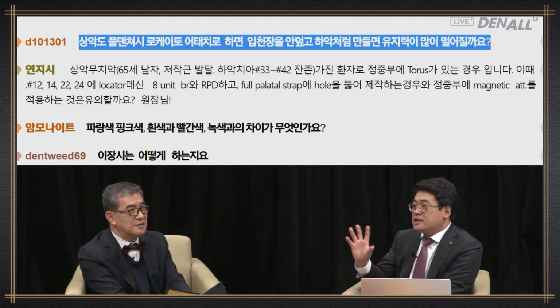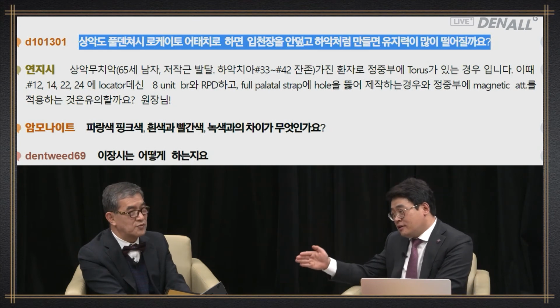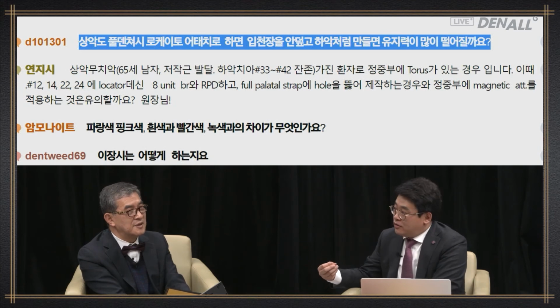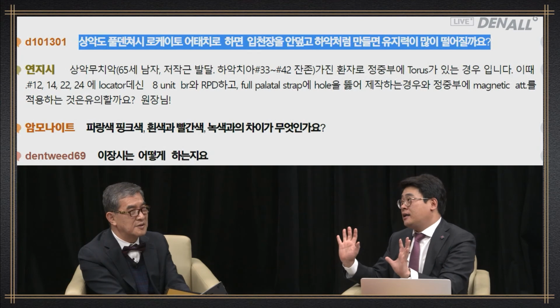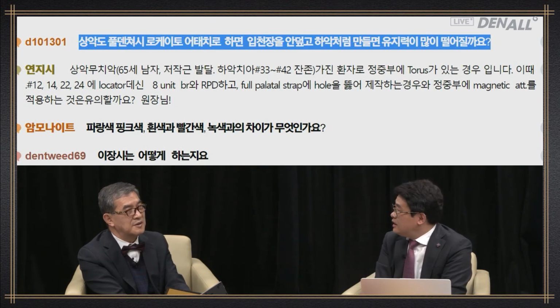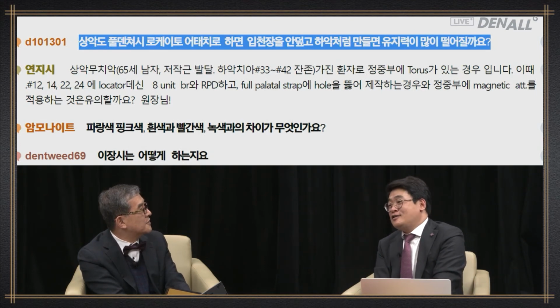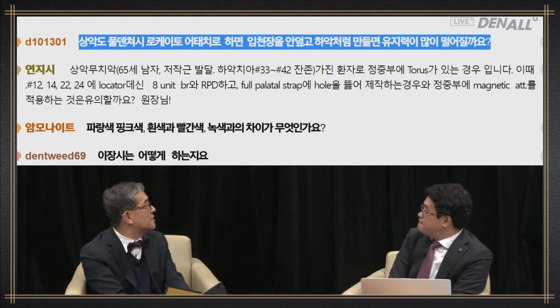And there are different types of palate. For people with a deep palatal vault, we can use the AP palatal strap type. And if it is flat, there is no horizontal stability. So if possible, you need to cover the palate to disperse the occlusal force. In the upper, the palate is where it occurs most efficiently. If you punch it out just because the patient complains of discomfort, you don't know what's going to happen. Therefore, I recommend covering it.